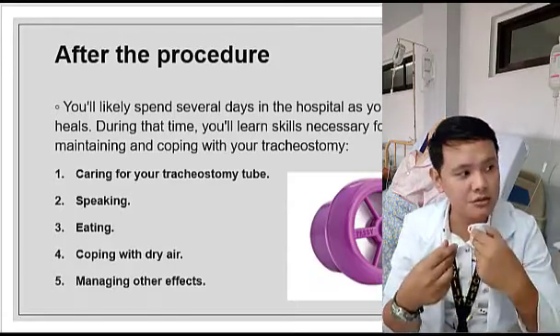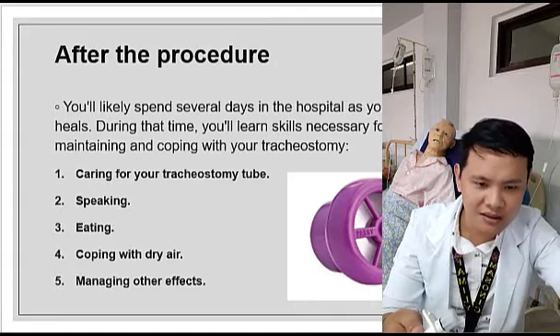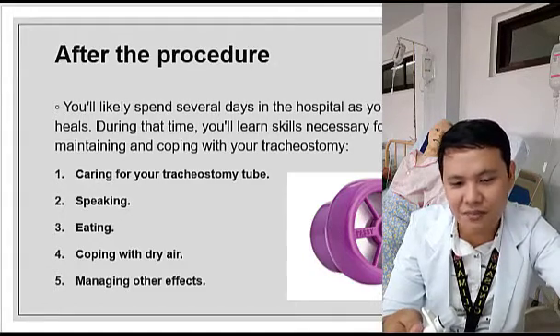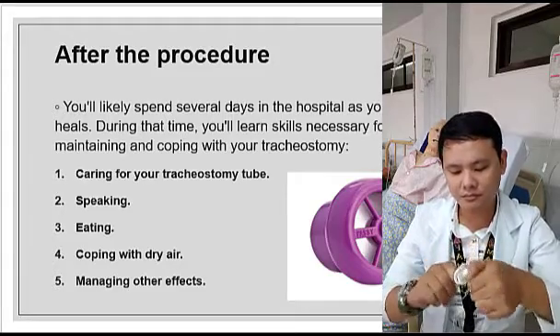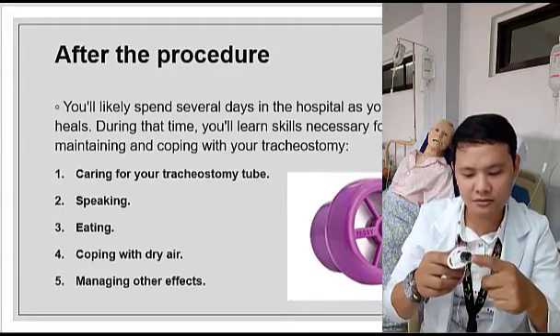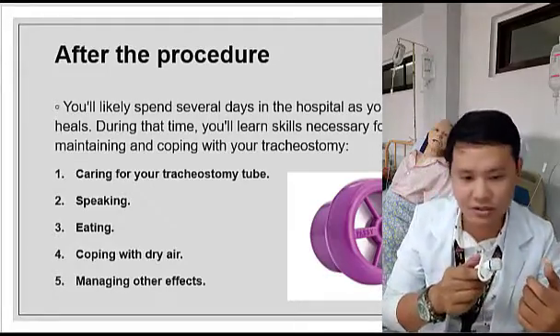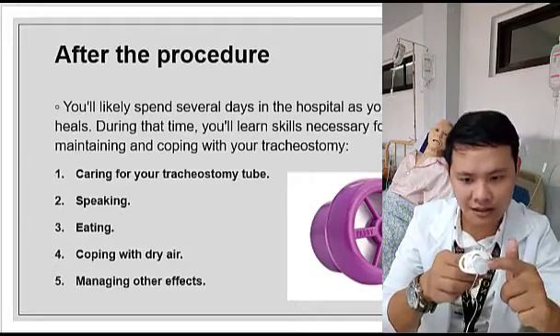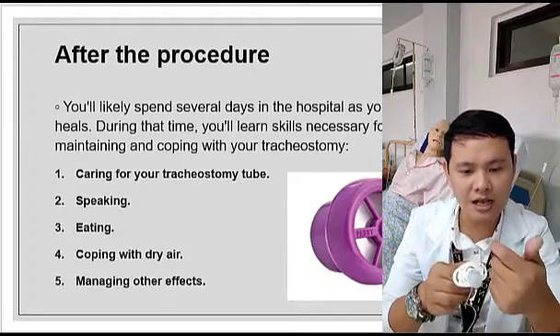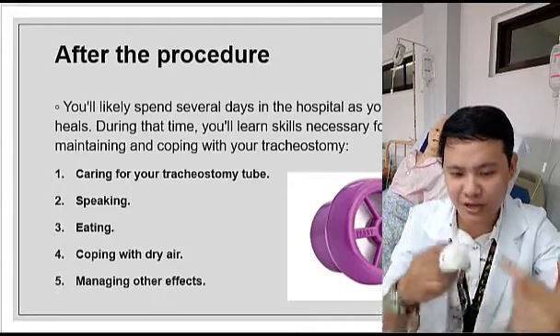Okay, na place dun sa may tracheostomy mo. Okay, as you can see in this picture, this is actually a valve. Itong valve po na ito ay nilalagay po dito. Okay, nilalagay po siya dito. Yung valve na yan, unfortunately, hindi available ngayon sa manual natin, wala tayong ganyan. If you put that valve here, pag huminga ka, mag-open yung valve, papasok yung hangin.